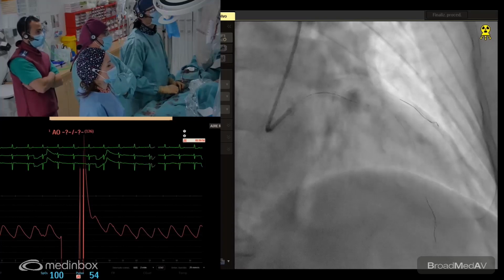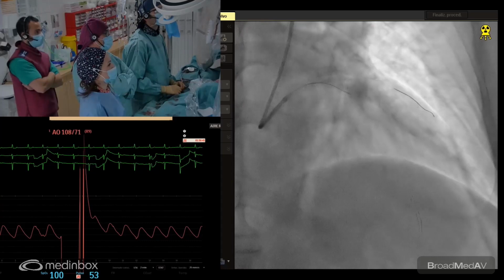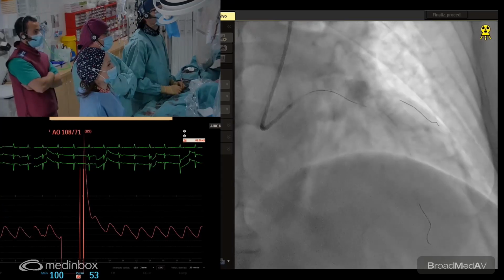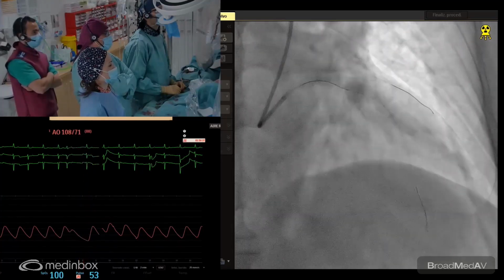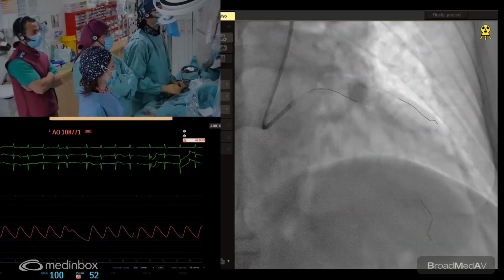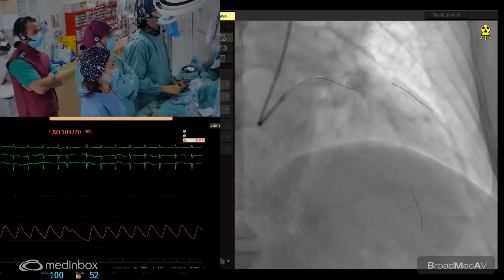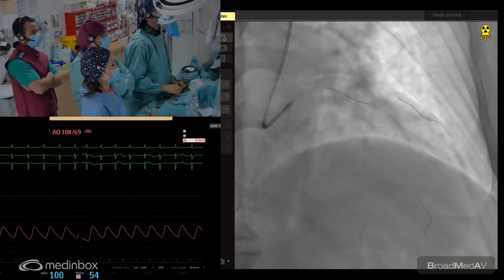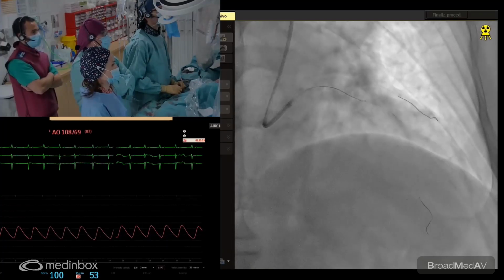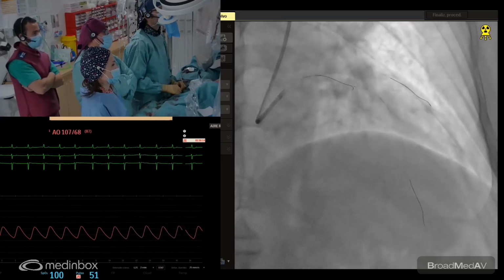You can see both markers of the dual lumen, and the wire is exiting just at the proximal marker. It doesn't help me much more here. But we need a... and I don't want to do a knuckle there.